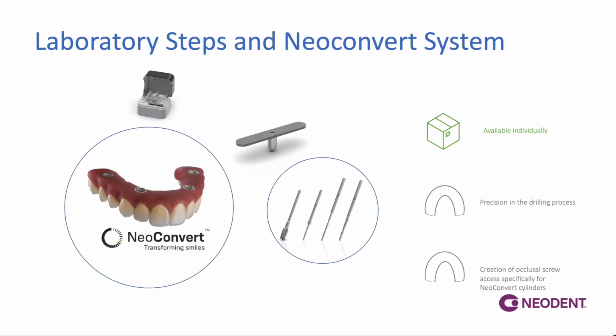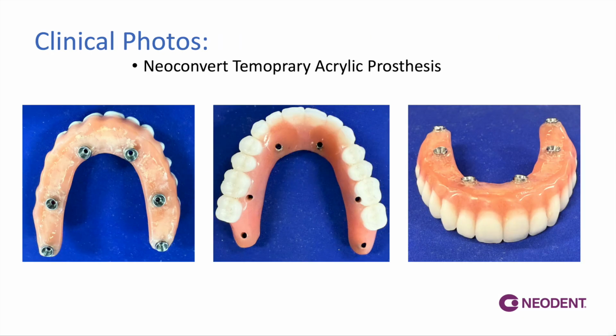And then we go in and do all of the laboratory steps for the Neoconvert system to convert this into a wonderful Neoconvert temporary acrylic prosthesis. As you can see here, we have adequate restorative space. As you can see here, we have not excessively drilled through our prosthesis. It is going to be very, very strong. It most likely will not break in the postoperative period.